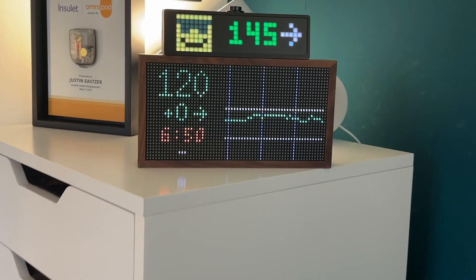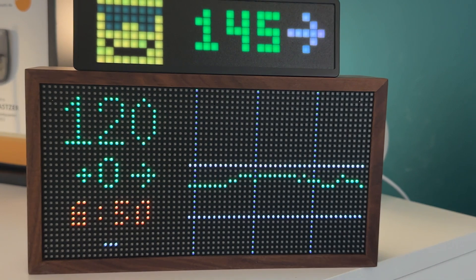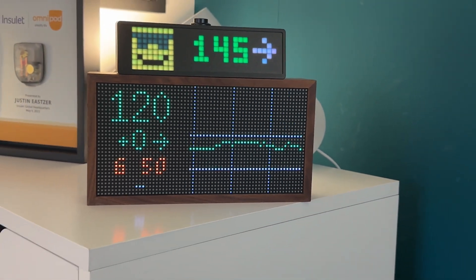The steps I show you today also work for devices like back there. I've got a Tidbit down there, which actually has my Libre 3 numbers right now. And then there's SugarPixel on top — that's using my Dexcom readings, but using those same steps, you can get your Libre sensor data on that as well. There's also the ability to put a widget on the home screen, which I'll explain how to do that as well.